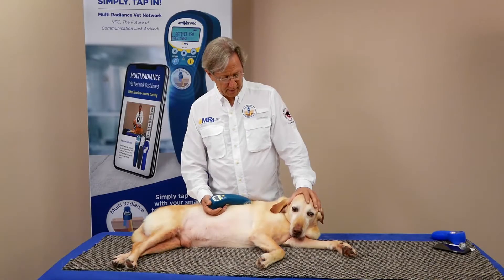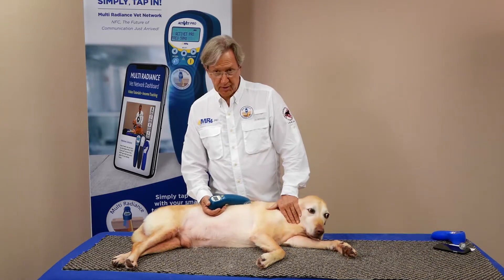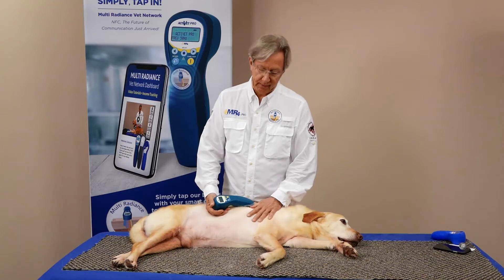The next protocol we'd like to talk to you about today is for lymphatic drainage. Swelling with interstitial fluid is another condition for which the laser is very effective.